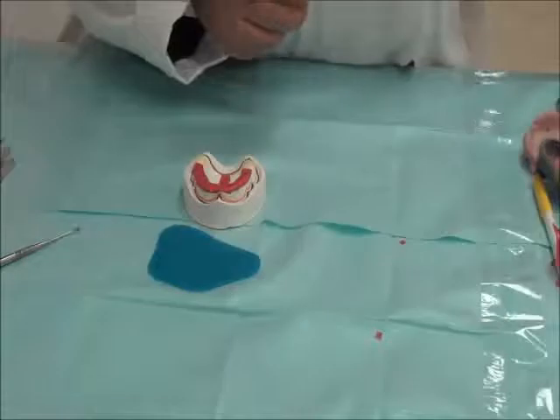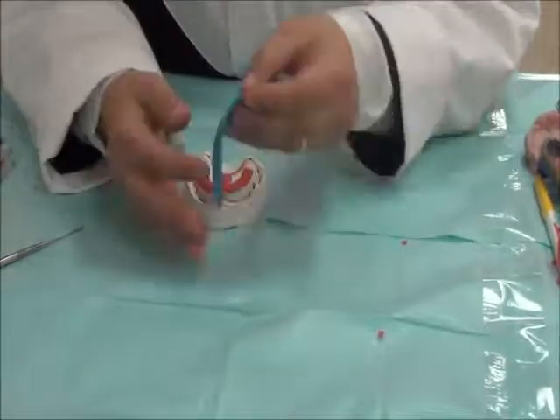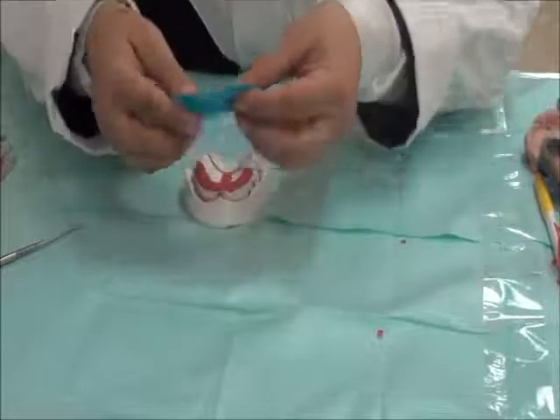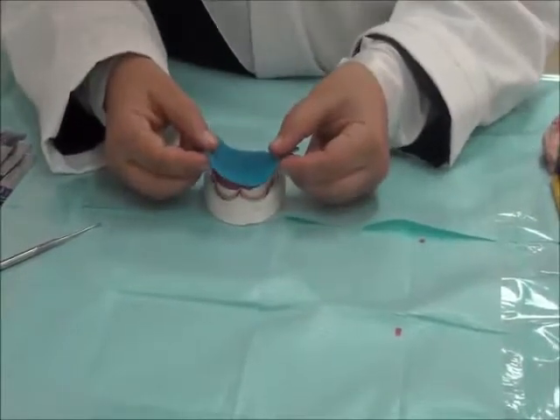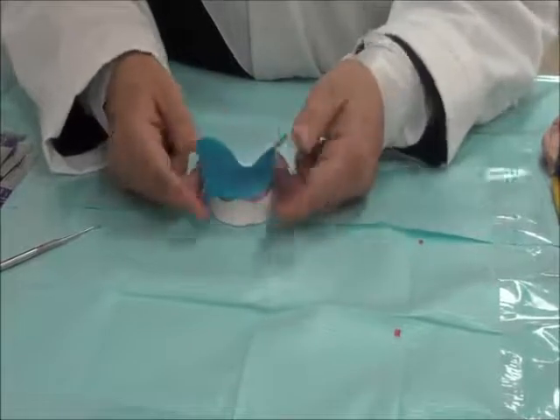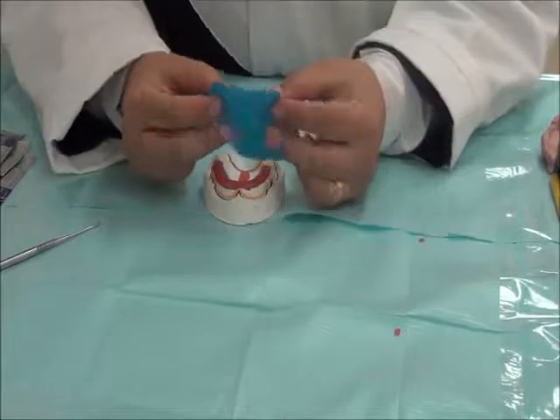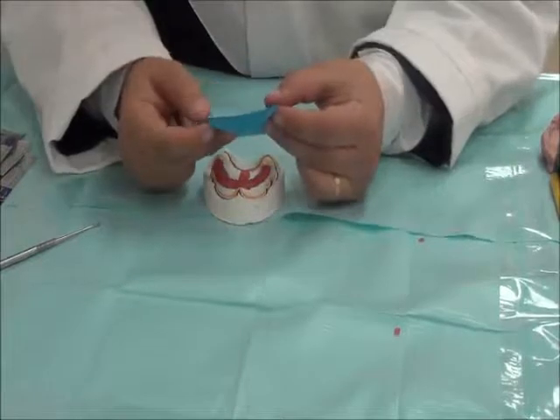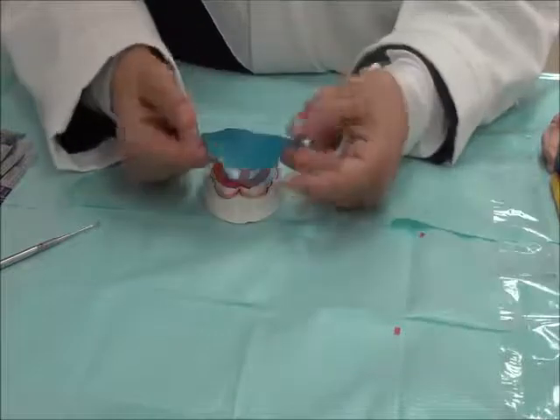We make sure the box is sealed, and the sheet we get comes in a shape that corresponds with the shapes of most casts. So it has this outline form where the anterior and posterior edges are there. It also has uniform thickness. So although it's like a dough, it has a uniform thickness throughout.